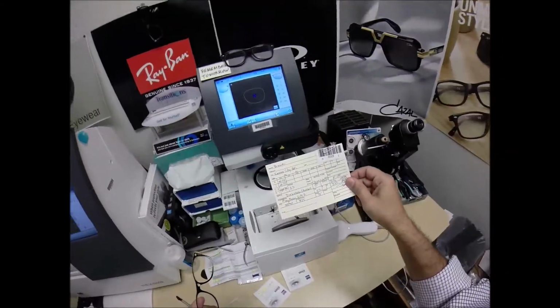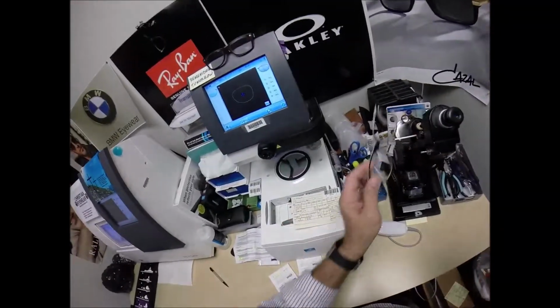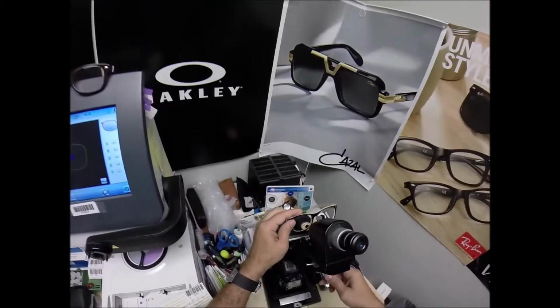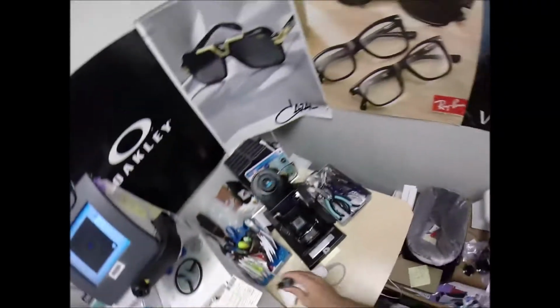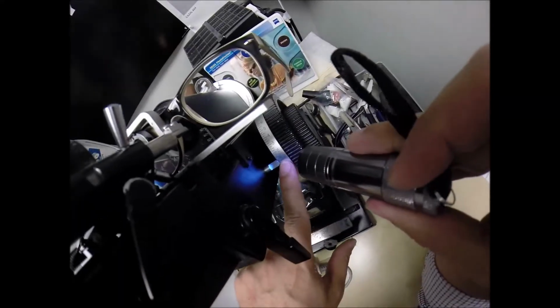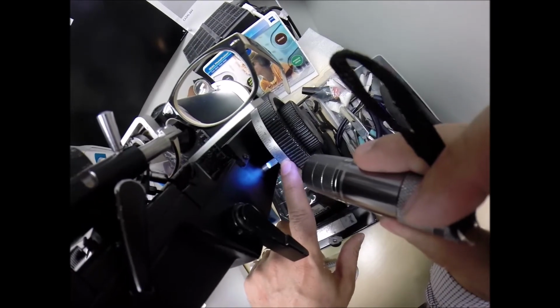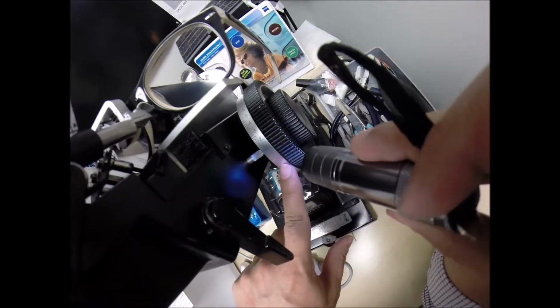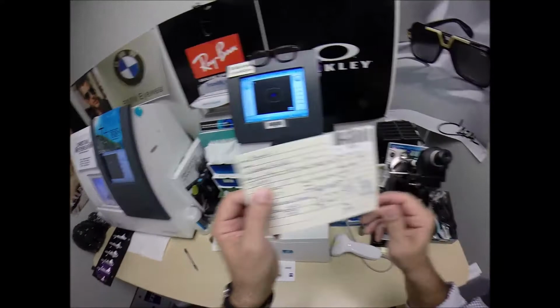So, what I'm doing now is called final inspection. I'm going to inspect the lenses to make sure everything is made exactly how it was prescribed. So, I'm going to put it in over that black dot. Read the power. And I'm getting plus 0.75, going away from 0 towards 1, plus a quarter, plus 0.50, 0.75, one tick mark away from 1 in the black plus numbers, not the red minuses, the plus, because you need 3 steps of magnification.